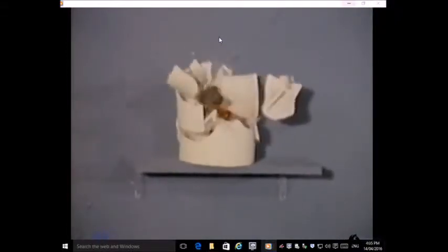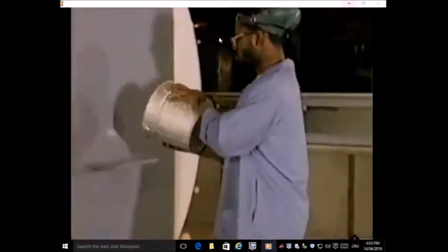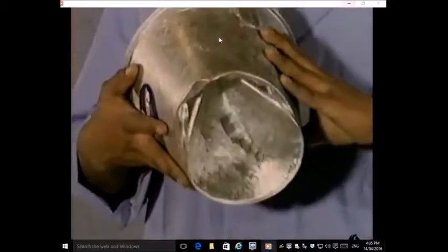Scanner, they've built a small wall in front of it and then let a spanner go. Not that any of you are going to take a spanner into an MR scanner, but you get the general feeling that if you take the wrong sort of implant in there, it can have a catastrophic effect on a patient. So you can see that it smashes right through the bucket.